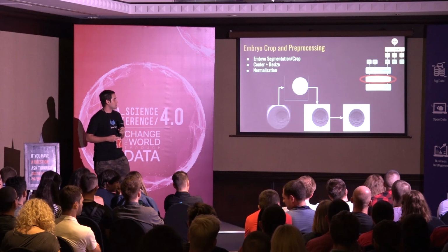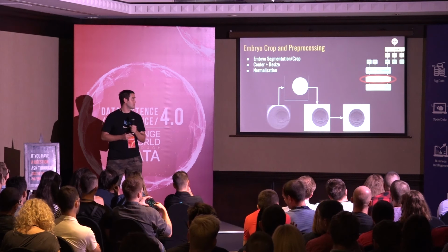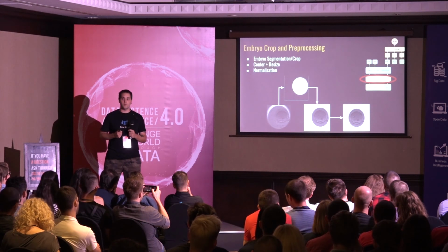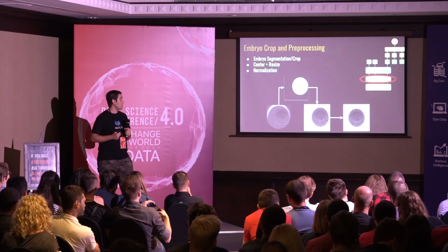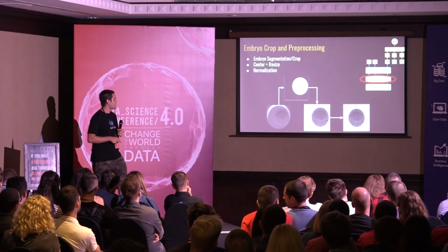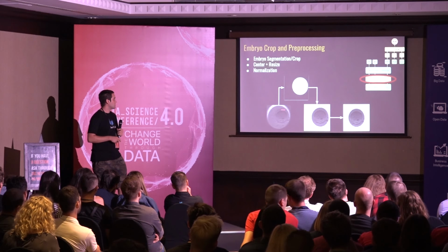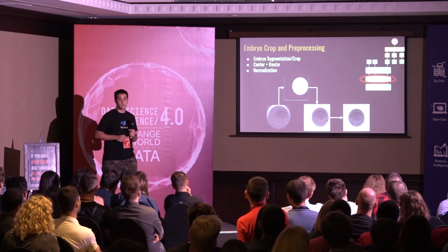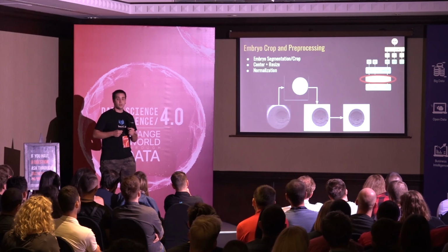So the first module is about extracting the embryo from the image. Yes, this is an example of one frame. There is a dish, and there is an embryo in it. The embryo could be anywhere in this dish.